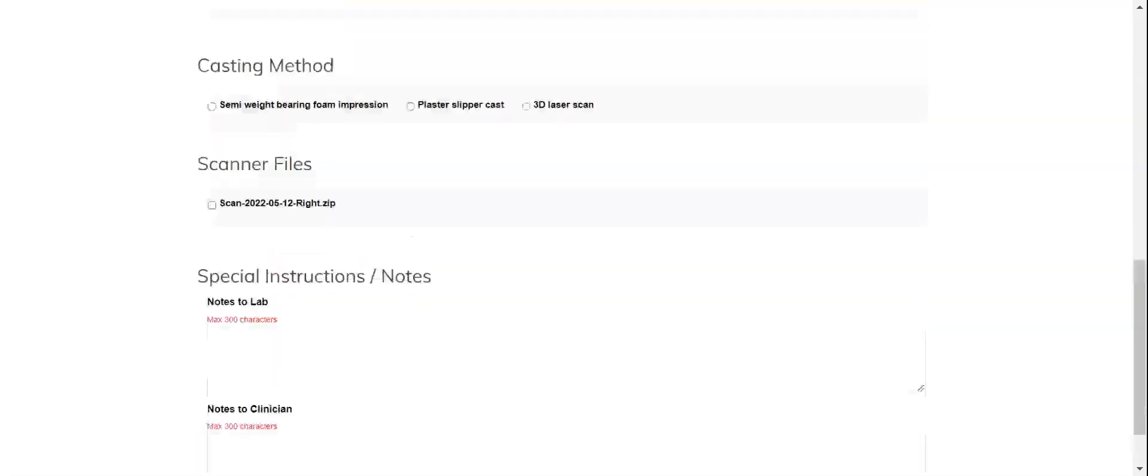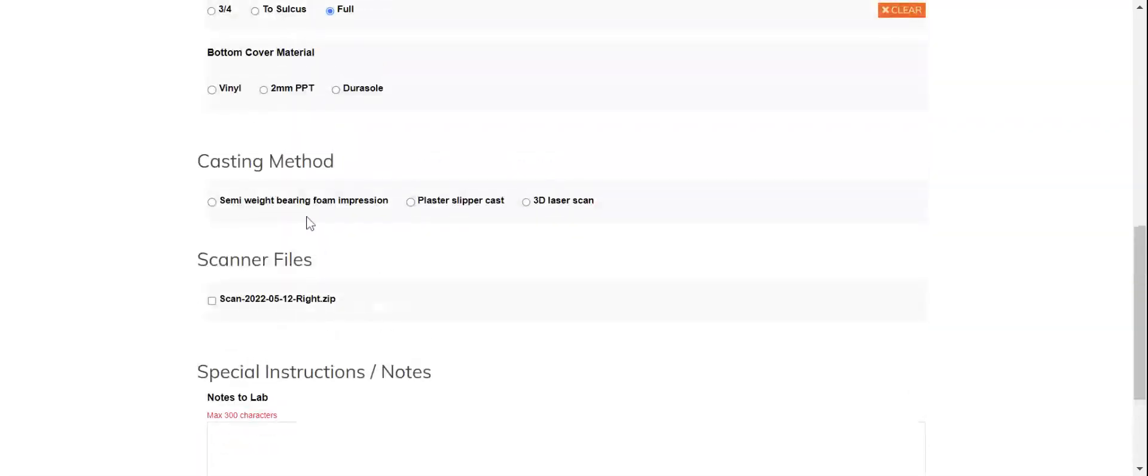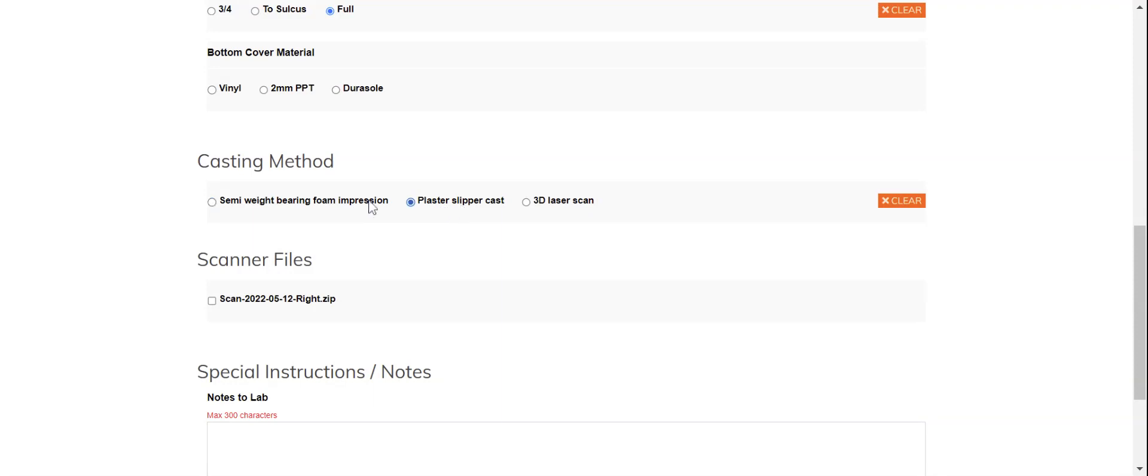For casting method we have options for our traditional physical impressions. If you are going to be mailing us or sending us a physical foam impression or a slipper cast, this lets us know that that will be on its way and this order will just sit in limbo until that arrives.